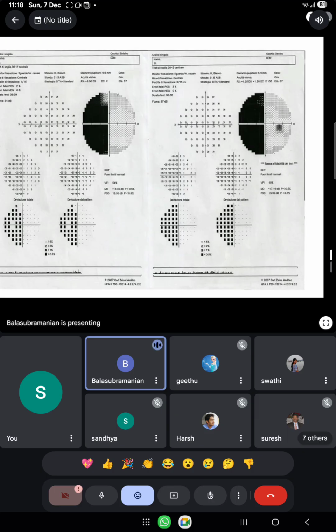You said left hemianopia, right? Okay. Is that what you wanted to say? Left hemianopia? Doctor? Left homonymous hemianopia, ma'am. Yes, homonymous hemianopia. Because left hemianopia is the diagnosis for a single eye. This is the chart of both eyes. So it is either homonymous or heteronymous, which you have to mention. Single left hemianopia is only for a single eye that does the diagnosis.